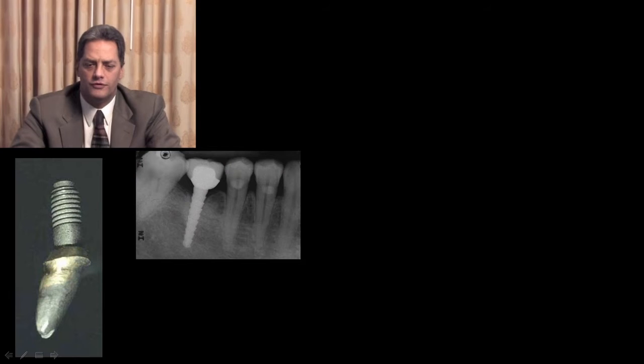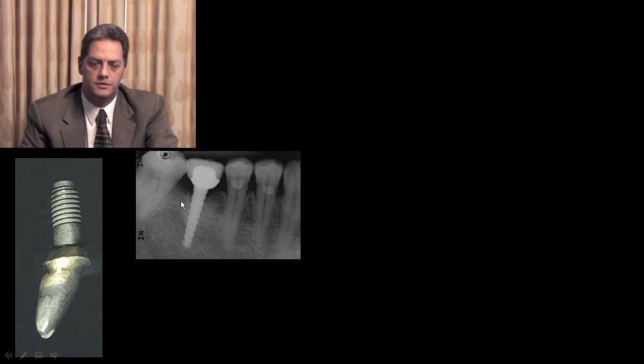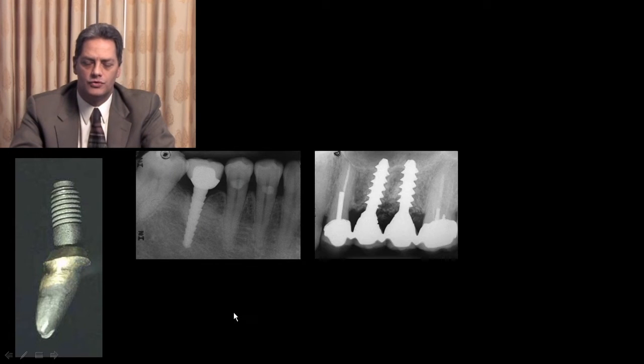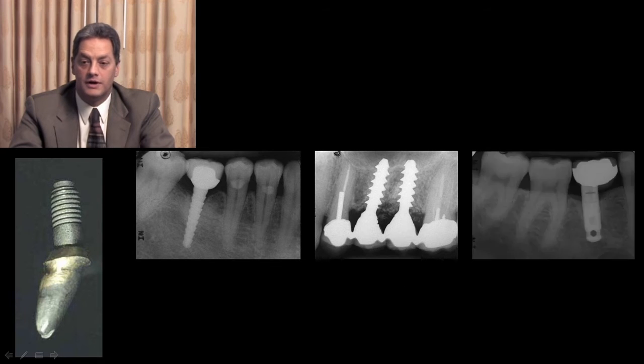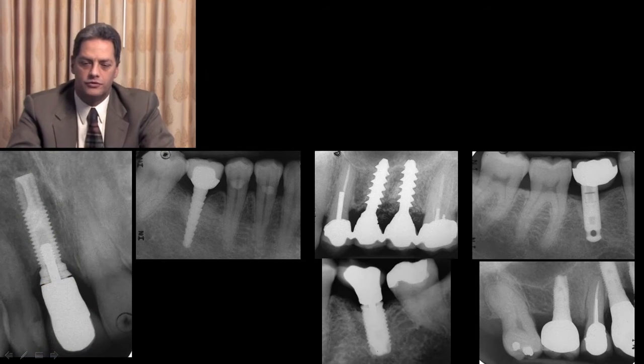So implants were evolving to different types of designs, such as the lower molar that we see here, a very narrow screw, and these upper screws, with different designs, many times not integrating, or even having restorations that, while they integrate, the restoration does not have the profile that we envision a molar should have. And depending on the implant system, and depending on where the implant is actually placed, we will have different contours.